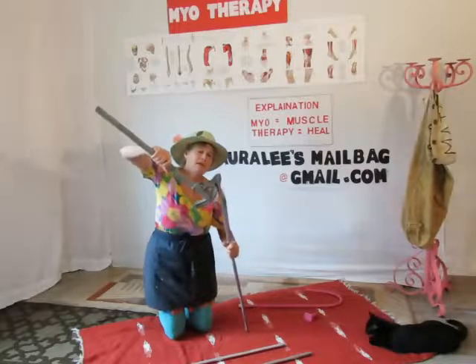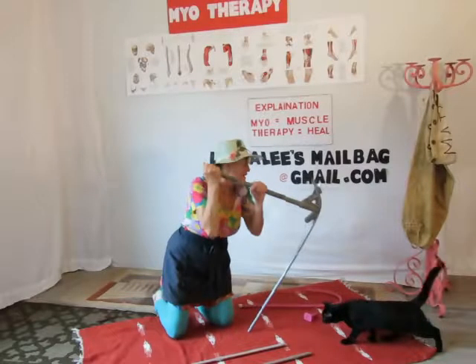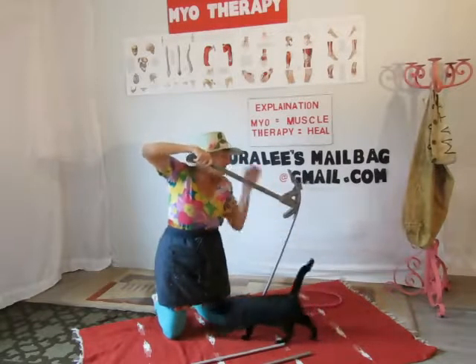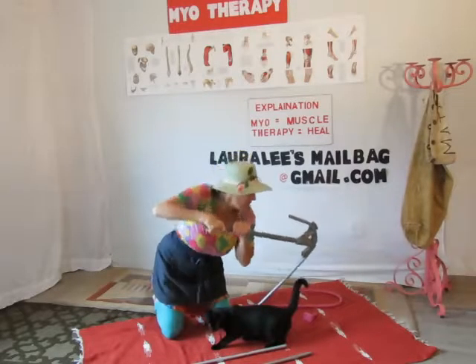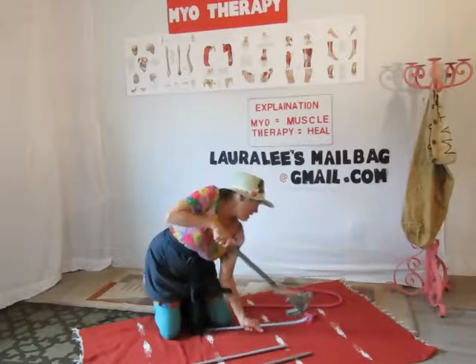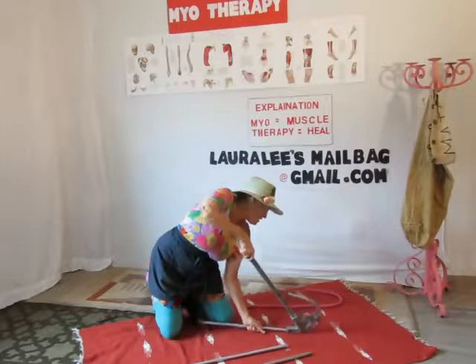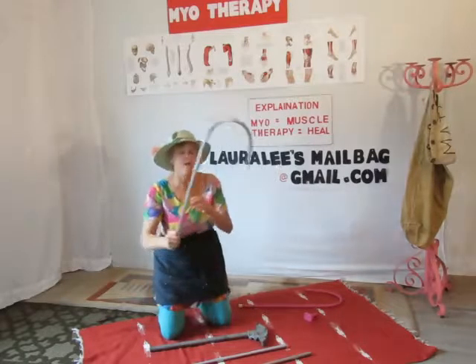You put the pipe bender on and you get good at this as you go. You just bend it like this, slide down a little bit more, and bend it a little bit more. You can make different sizes out of this. I'll finish this up when I'm done, but you get the idea.